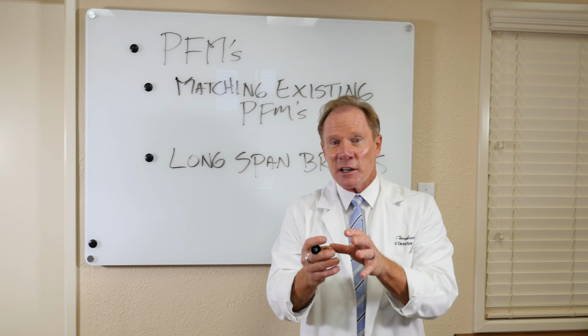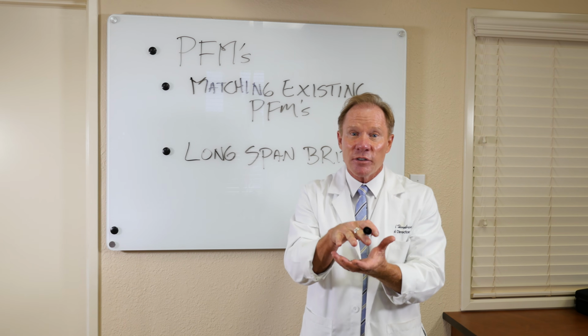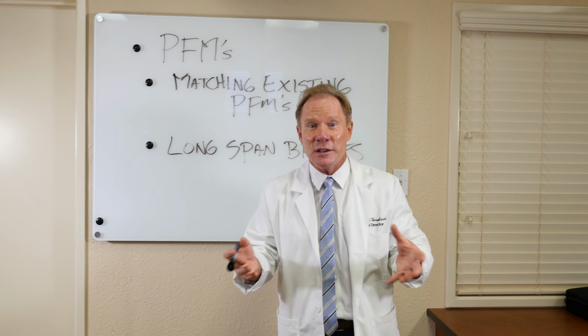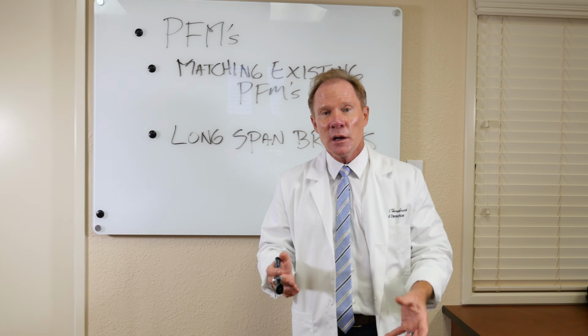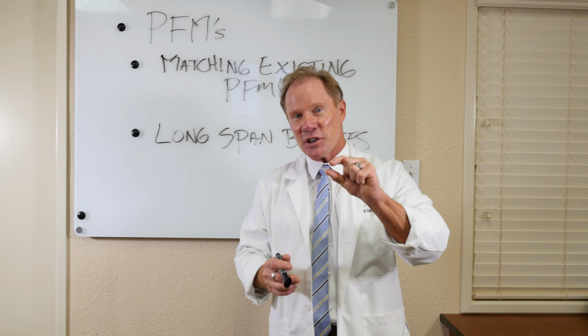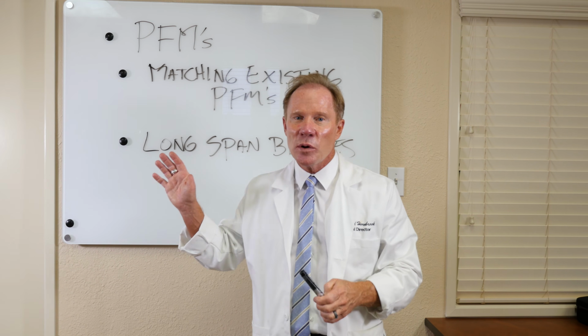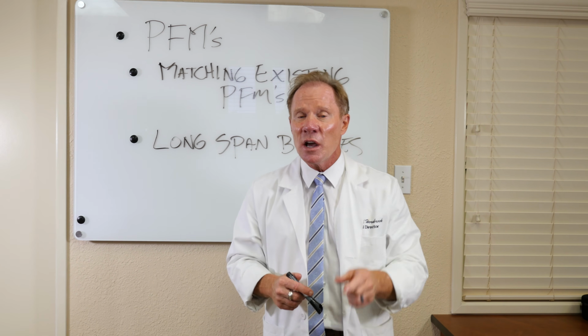Lots of times the connectors, because we have this collapsed vertical and the patient isn't going to do a full mouth rehab, so we need to deal with that restoratively. In order to get connectors that are thick enough, we need to go with metal. But really at this point, this is the only time I use these materials.